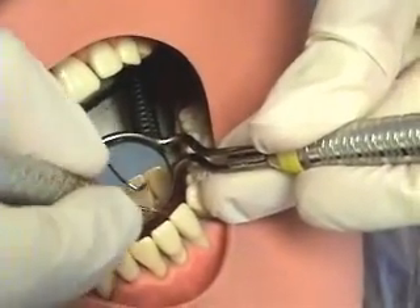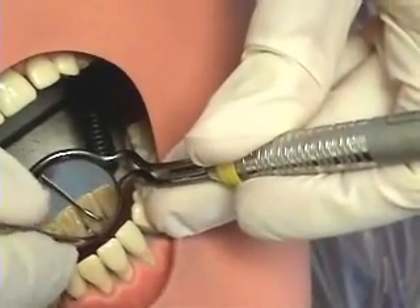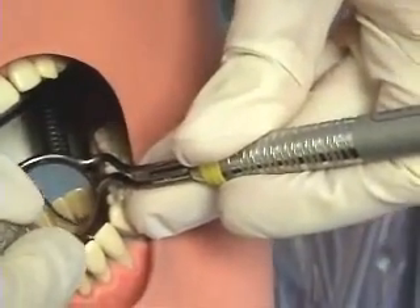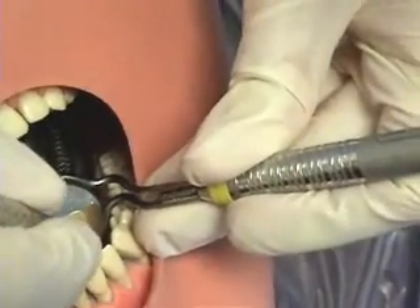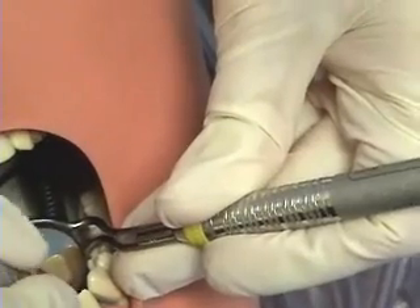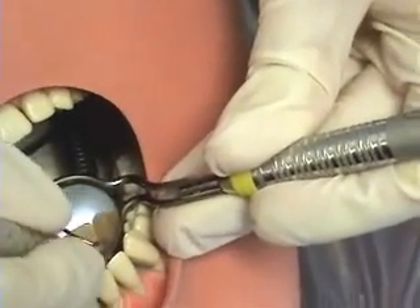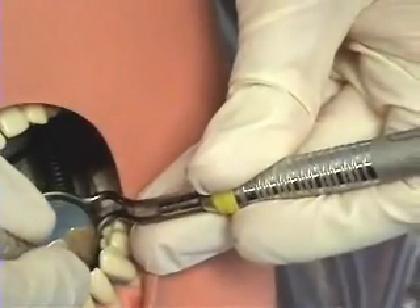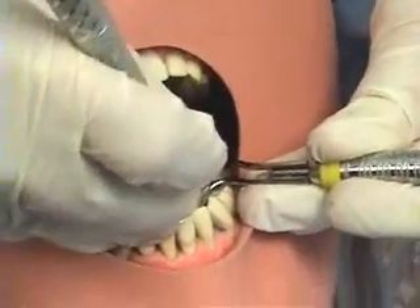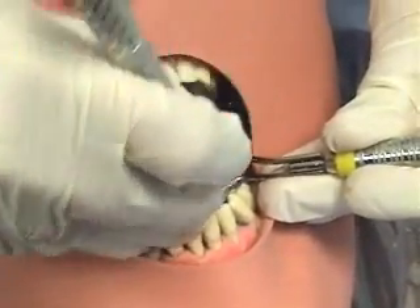Note that due to the fact this instrument ends in a sharp tip, it is not used subgingivally. The only exception is if the tissue is quite distendable — you may go possibly a millimeter apical to the free gingival margin for calculus removal. You always go to the most apical portion of the calculus and remove with a short, powerful pull stroke after exerting lateral pressure against the tooth. The terminal shank is kept parallel to the long axis of the tooth, and notice how the clinician is scaling in the direction she is moving, with a beautiful rocking arm motion on her finger rest.